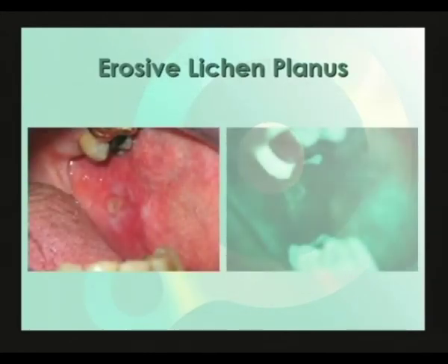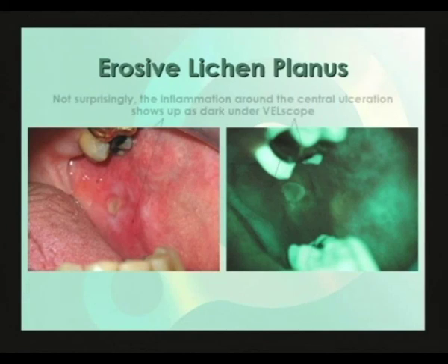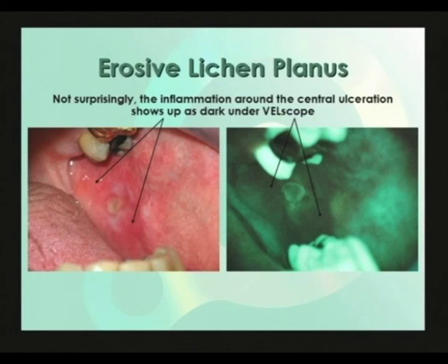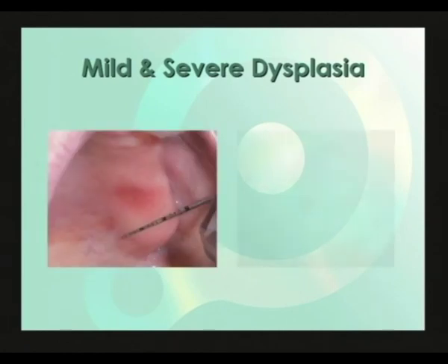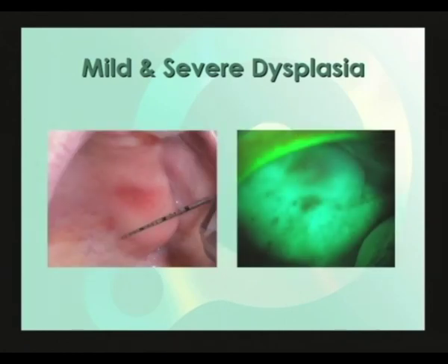This is an example of erosive lichen planus. Not surprisingly, the inflammation around the central ulceration shows up as dark under VELscope. Notice also that the keratinized tissue and central fibrin clot show up brighter compared to the surrounding inflammation.